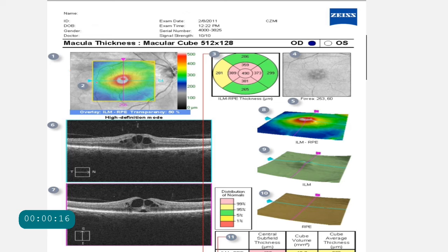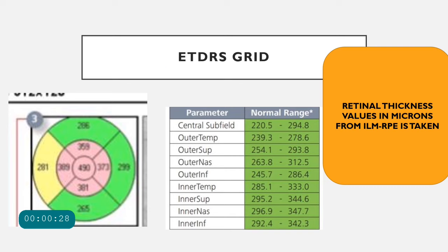After the SLO fundus image and the slice navigator, we have the ETDRS grid. ETDRS stands for Early Treatment of Diabetic Retinopathy Study grid. In this grid, the macular thickness is represented — calculated from the internal limiting membrane up to the retinal pigment epithelium. The ETDRS grid consists of three circles: the outer circle, the inner circle, and the innermost circle. The innermost circle represents the central subfield thickness of the macula. Each circle is divided into four quadrants, giving about nine sectors overall, all representing the thickness of the macula discovered in the patient.